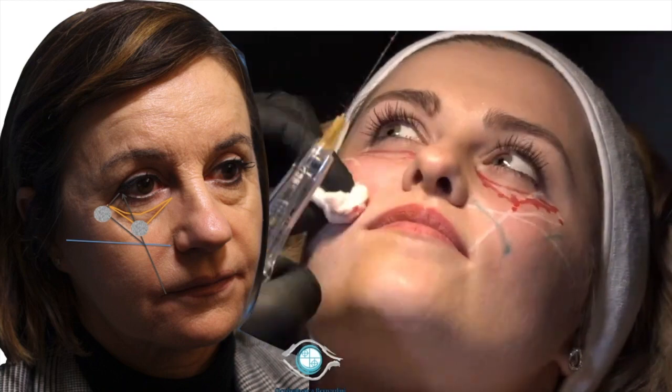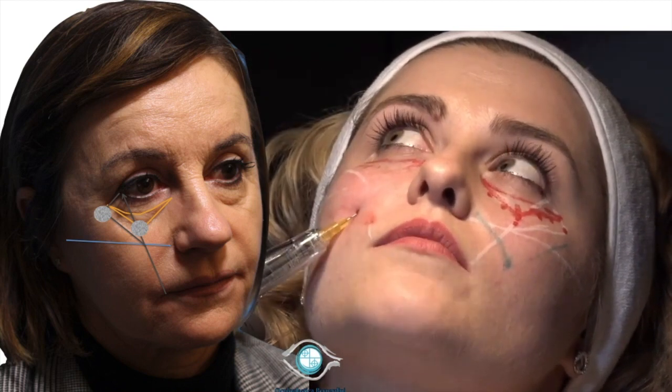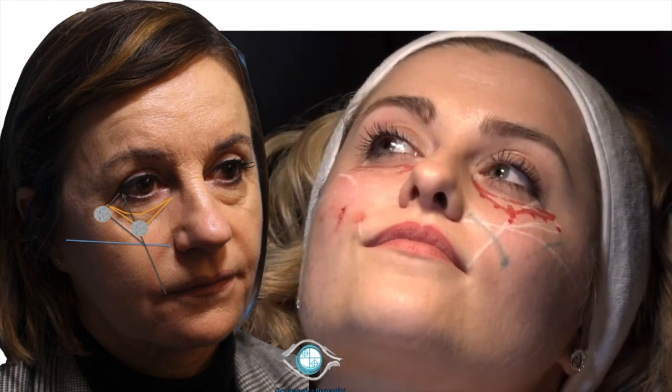We are, of course, forming macro boluses which are potentially visible as lumps, so we really need to drive to harmonize whatever is on each side. And we go all the way around the infra-orbital region.